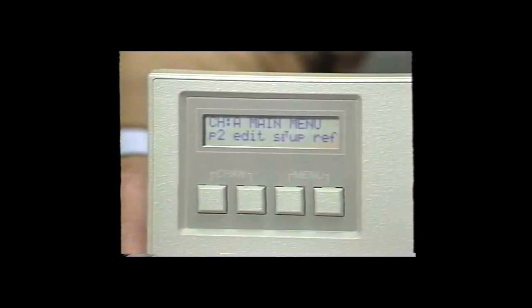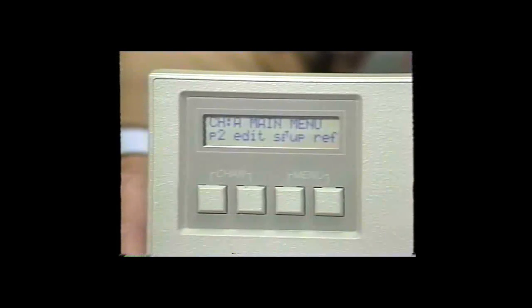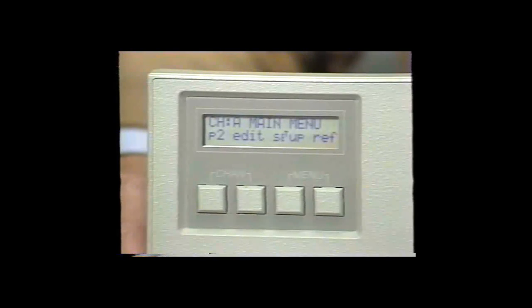Page two of the main menu is used to access functions not normally used in everyday operations, such as Edit, the Setup Modes, and the Reference Positions. Edit allows you to set your control limits for your processor. It also allows you to enter the channel name and to change the equation format to calculate the process control parameters.